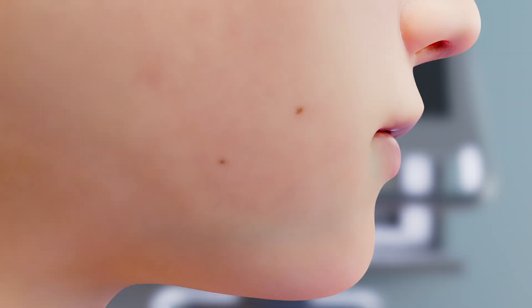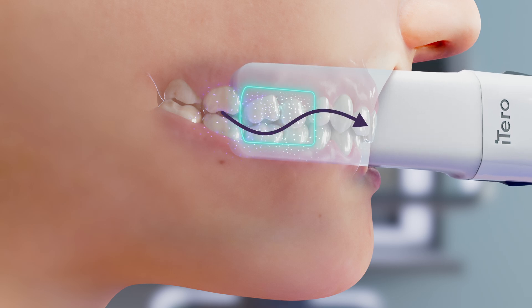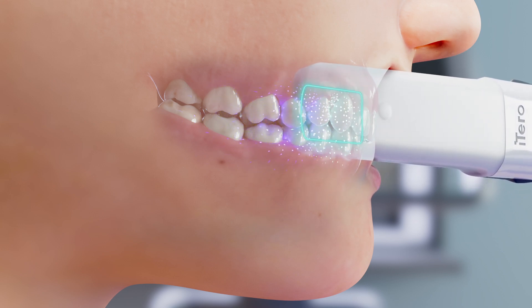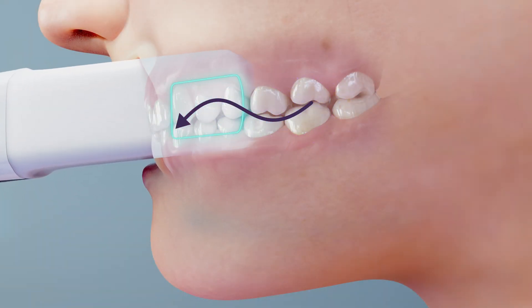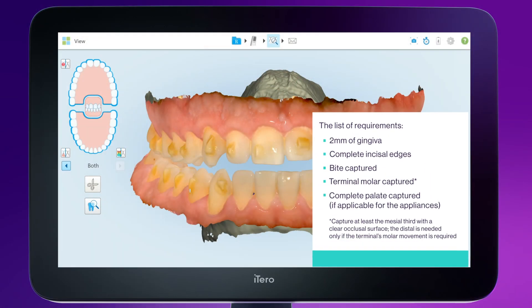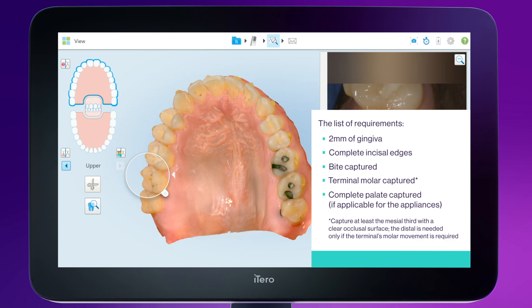Scan the bite. Ask the patient to open their mouth and place the wand parallel to the teeth. Use the wand to retract the cheek — pull the cheek away from the teeth and turn on the wand. Capture three or four teeth while moving forward in a slight wave-like motion. You don't have to touch the teeth. Once captured, turn off the wand. Move to the contralateral side with the patient's bite remaining closed, using the same technique. Review the complete scan in color and monochrome mode to ensure the complete anatomy is accurately captured.